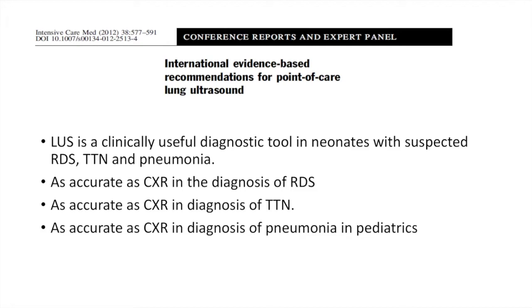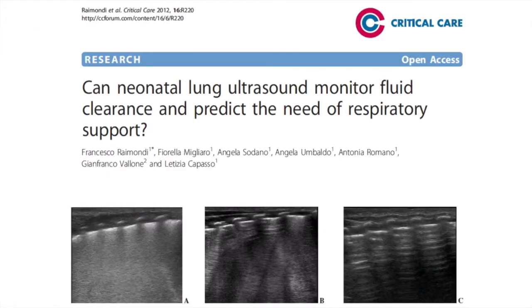The evidence from the International Evidence-Based Recommendations in 2012 reported that lung ultrasound is a clinically useful diagnostic tool in neonates with suspected RDS, TTN, and pneumonia. It is as accurate as chest X-ray in the diagnosis of RDS, as accurate as chest X-ray in the diagnosis of TTN, and as accurate as chest X-ray in the diagnosis of pneumonia in pediatrics.